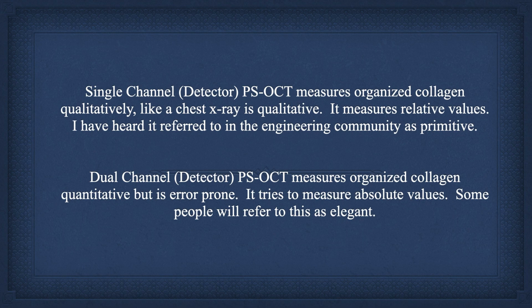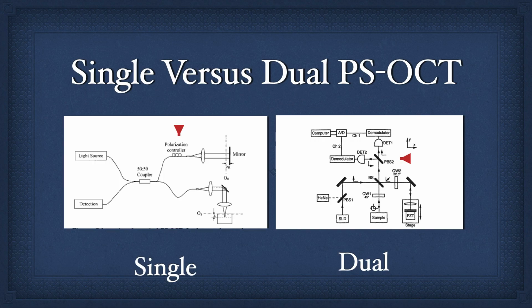But you use two detectors that allows you, if you understand that polarized light is composed of, let's say, an X and Y component in or out of phase. The two detectors allow you to measure each one of those, the X component, for instance, and the Y component for the sake of this talk.